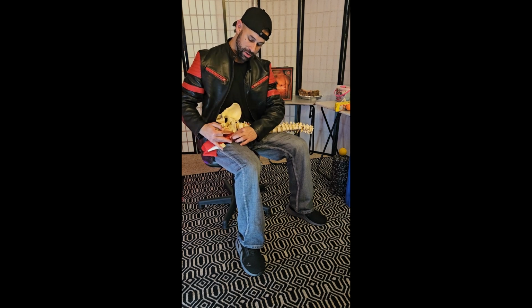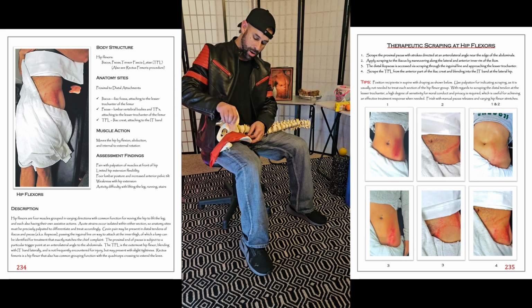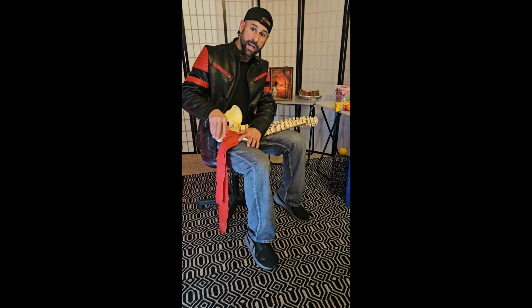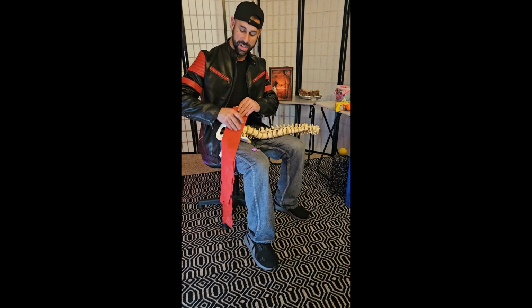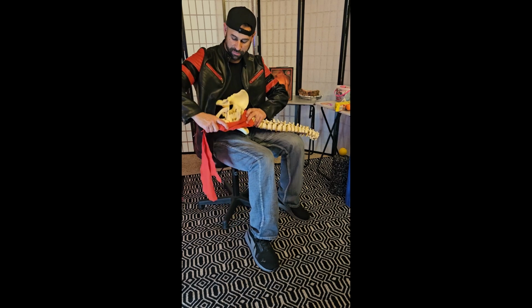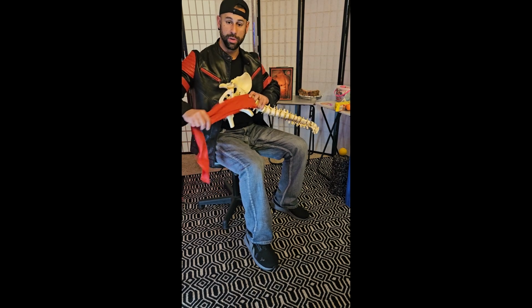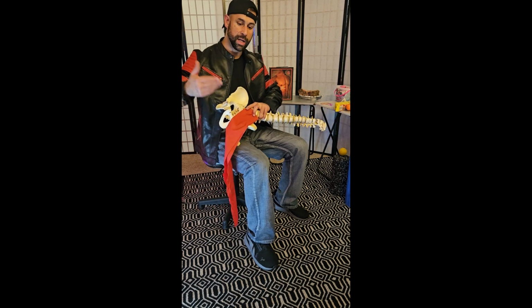if I was to apply therapeutic scraping to this, my tool would come along and feel for the rigidities, focus on scraping through those rigidities, and scan and assess for soft tissue restrictions through palpation using the tool. So now that I've smoothed that muscle out, I would be much more successful at applying active release techniques or any type of stretching techniques to get that muscle to stretch without the restriction embedded in there. And done right, you typically get an immediate result with that.